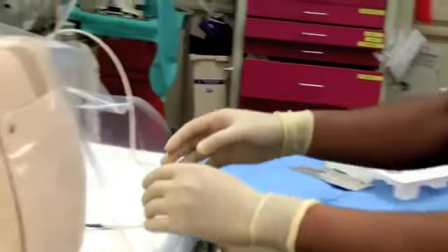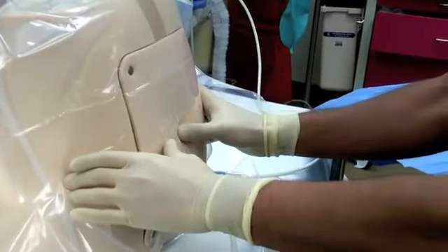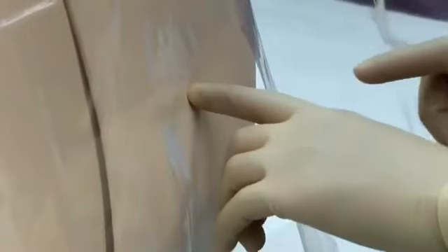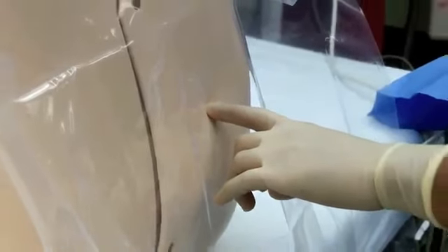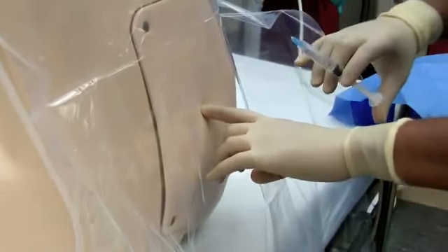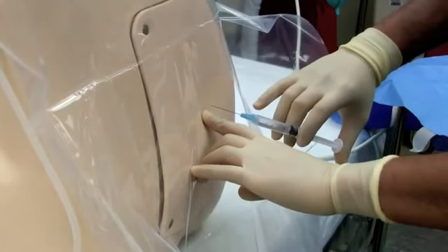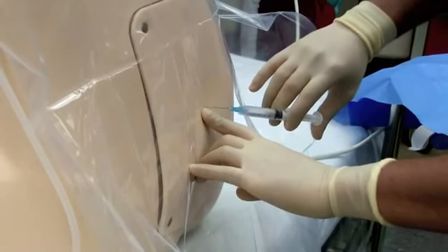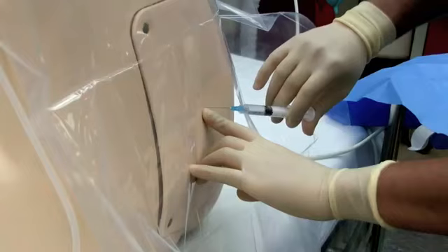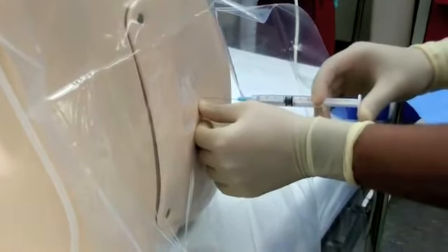So from the step prior, we're going to re-identify our space in the sterile field. I can feel my L4, L5 interspace. My finger, I'm going to infiltrate with the local anesthesia. Just warn your patient that they're going to feel a little pinch, and you want to raise a nice skin wheel. Administer some more local anesthetic.